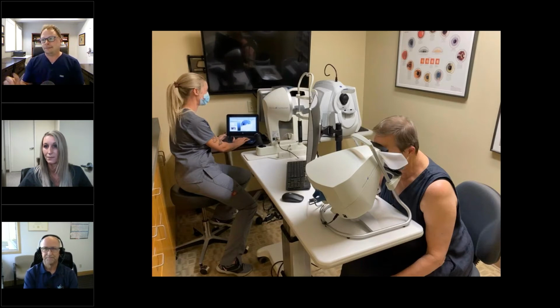I then just, like all other communication with the patient, at the end of the exam, tell them, hey, I've identified this risk factor. I need to order another medical test. This is why. And we're just going to do that now. And so I page the technician, they walk in, I leave the room. At that point, Brandy and her team would take over. That's right. Yeah. And that's when we would go, like I was saying earlier, sanitize, put the name in, put the birth date in. All of that's taken care of before we even go grab the patient.